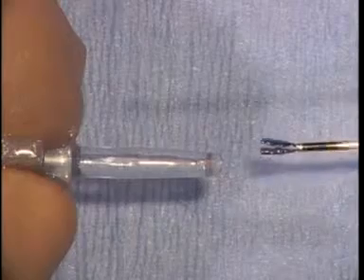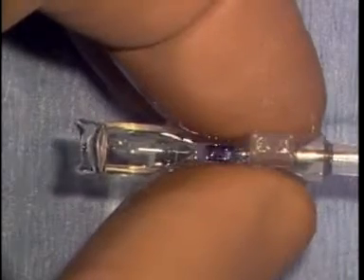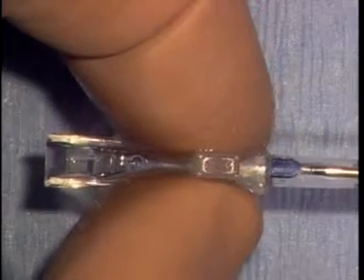Close the jaws of the Visian ICL loading forceps and insert them into the barrel from the front of the cartridge. Advance the forceps through the cartridge until the jaws are about to contact the leading edge of the ICL. Open the jaws of the forceps and grasp the footplate of the ICL so that the lens positioning mark is aligned with the jaws. Slowly pull the lens into the barrel while moving the cartridge in the opposite direction.